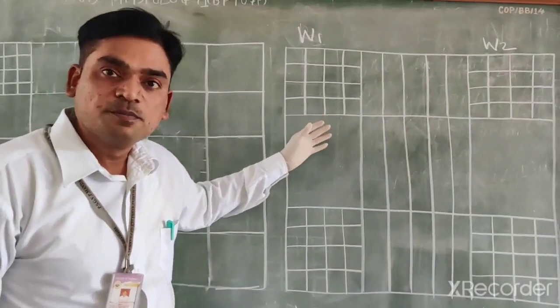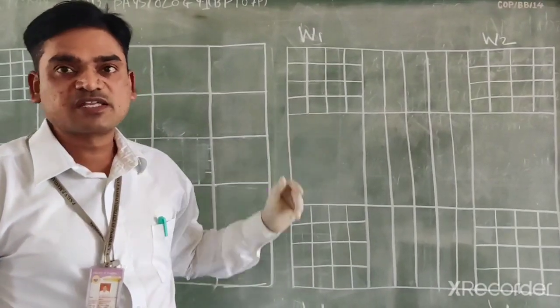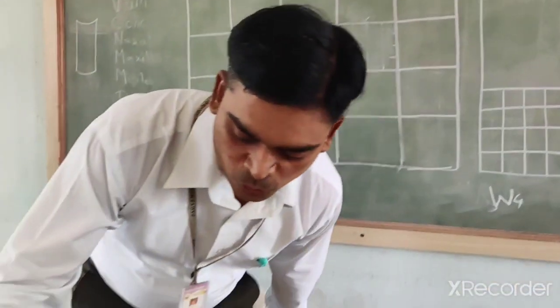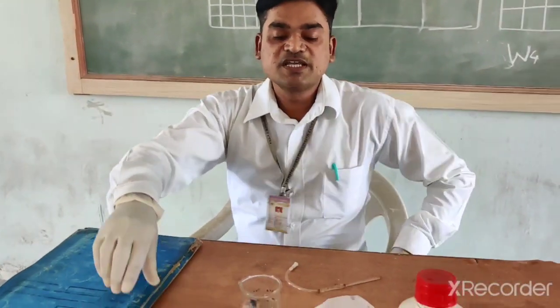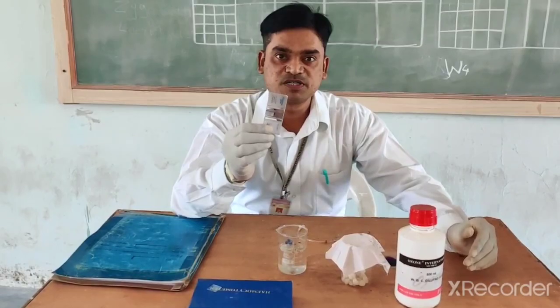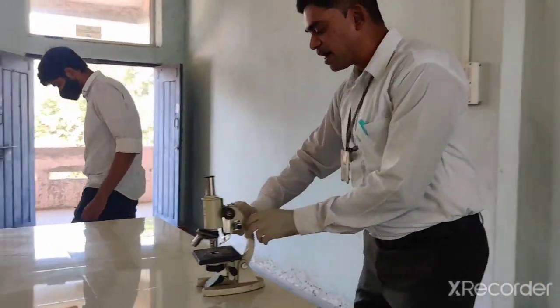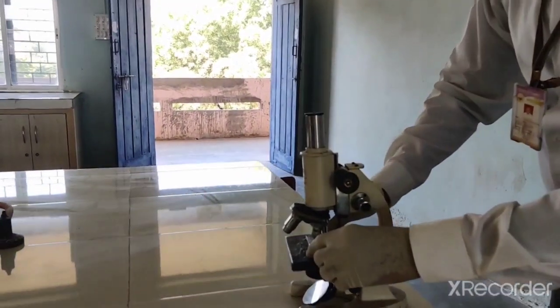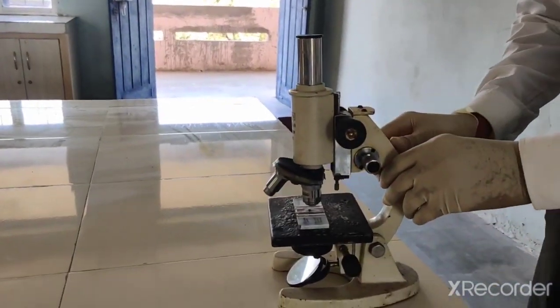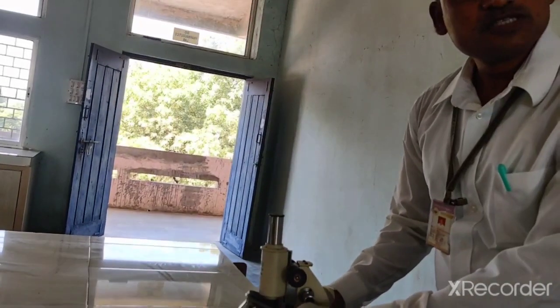Prior to starting, you should draw the blocks on your notebook. Now before starting, we should take this Neubauer chamber and set it into the microscope so that the lines are visible to you. You should see the lines of the WBC count.